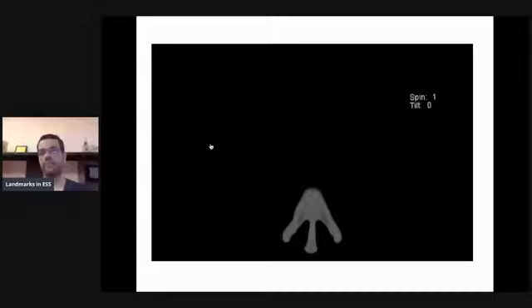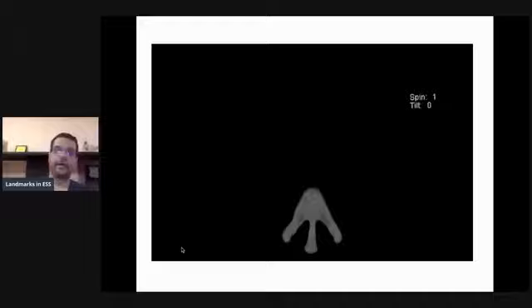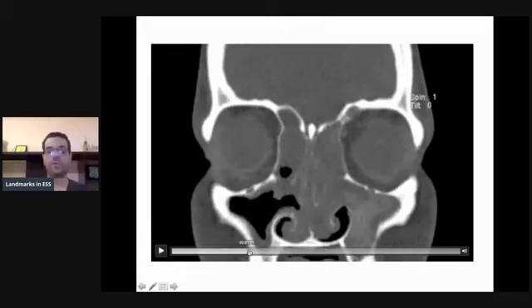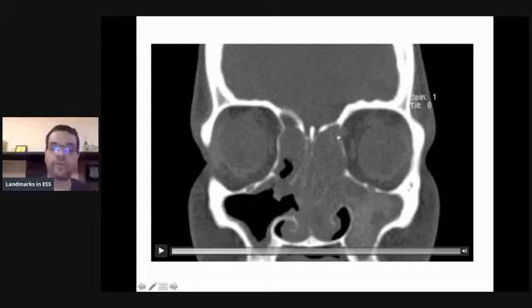I have reviewed the preoperative CT images for both patients and found them looking in the same way that I'm going to show you right now, looking something like this. And what is that? That's an anterior ethmoid artery lying in the skull base, but with eroded bone. You don't see bone below the anterior ethmoid artery in the skull base. And that's, in my opinion, the most dangerous scenario. You don't have a supraorbital pneumatization. You have an anterior ethmoid artery region that has no bone right here. And then the patient can very easily have an injury of the anterior ethmoid artery during surgery.